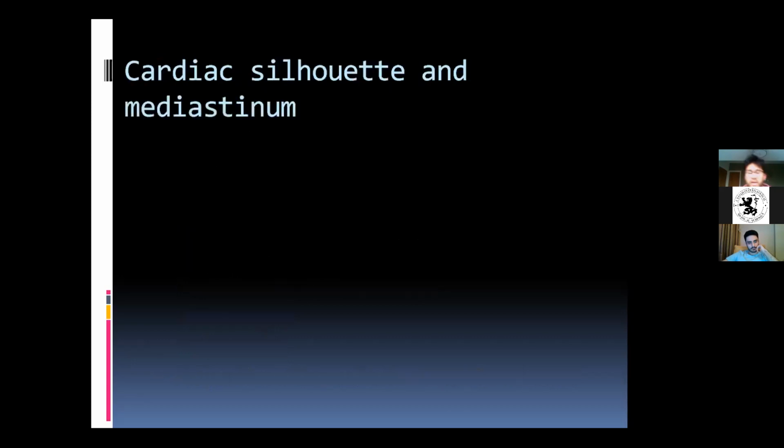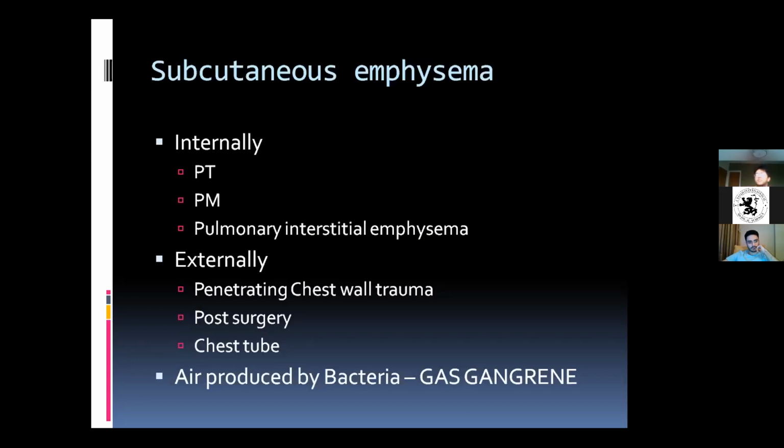Okay, so we've now kind of covered both airways. We've covered what the most common pathologies are in both of them. Let's carry on with cardiac next.